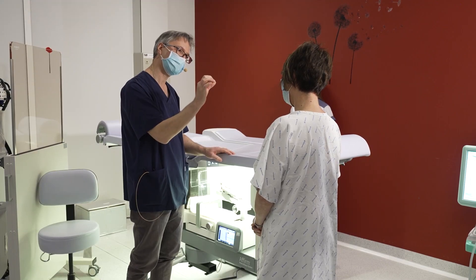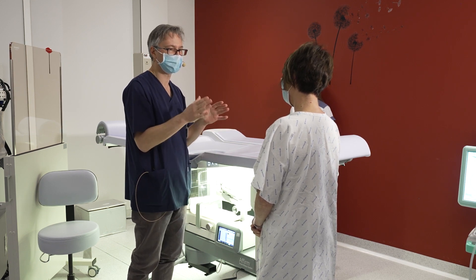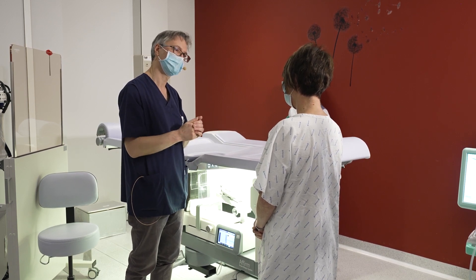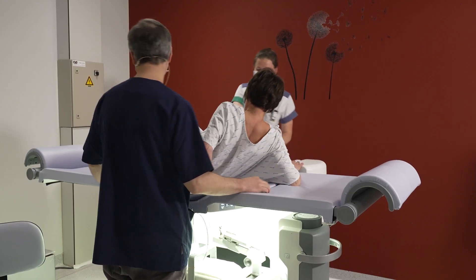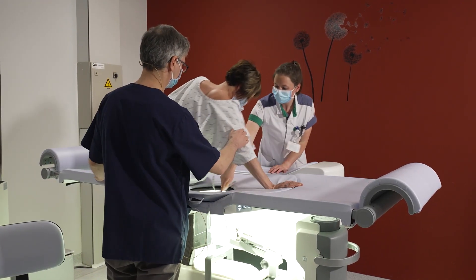Explaining the procedure of the biopsy to the patient is extremely important for the success of the procedure. It is important to reassure the patient to avoid anxiety and motion during the biopsy. We install the patient on the biopsy table and try to position the patient as comfortably as possible.